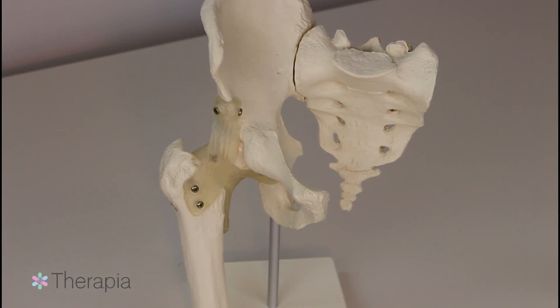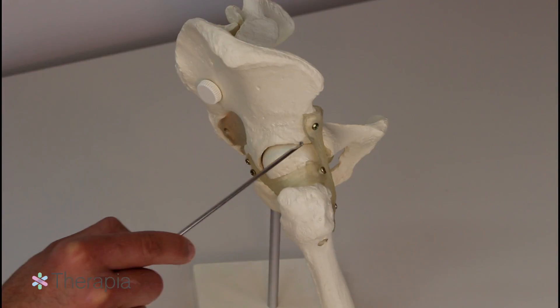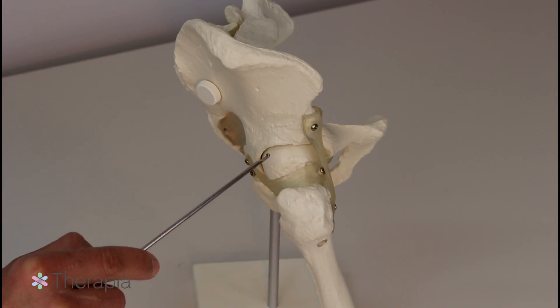To understand how a hip replacement works, let's do a brief overview of hip anatomy. The hip is a ball and socket joint. The socket side of the joint is called the acetabulum and the ball is the head of your femur.